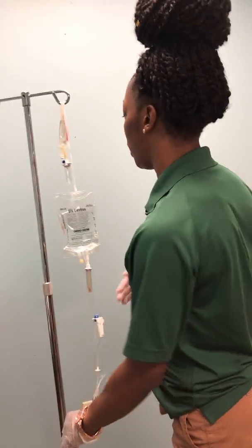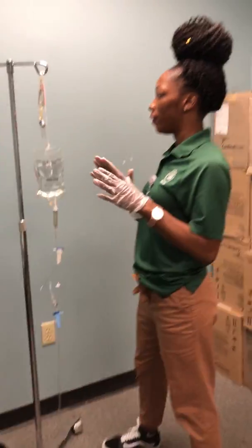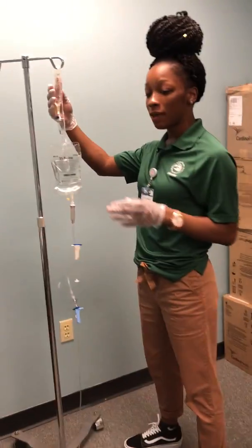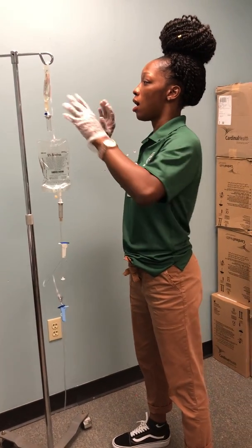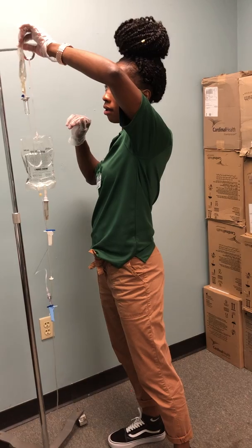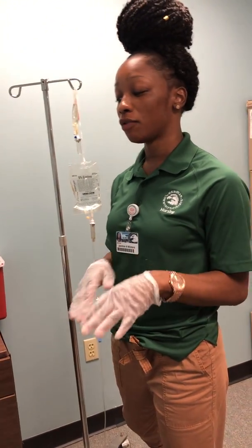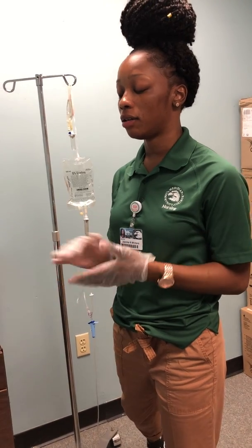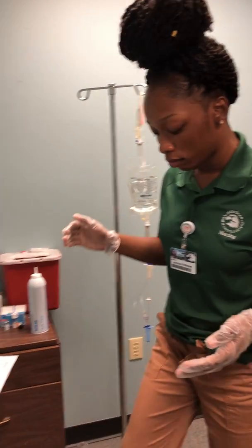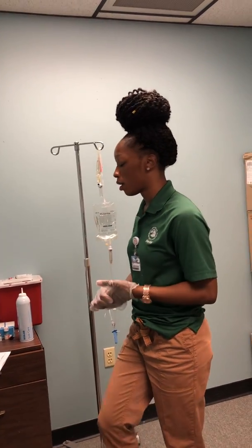Okay, now that I have my IV piggyback going at the correct rate, then it finishes and my IV piggyback is done, I would instruct my patient to ask for any assistance if they need help getting out of bed or going to the restroom, to use their call light.